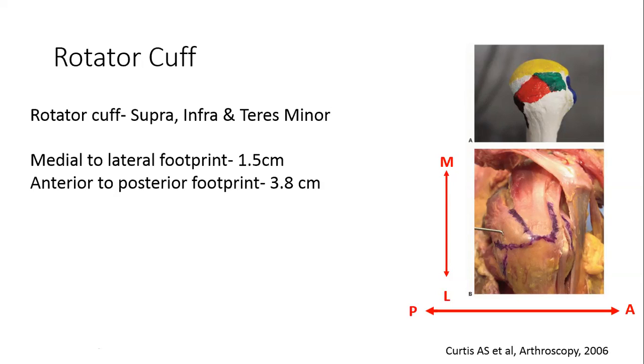And of course, when you're doing long axis, especially when you are doing it on a patient and you want to find if there are any focal defects, you don't want to just get one image where you get perfect supraspinatus long axis view. Because in that patient you may find some focal defects more posterior or more anterior.